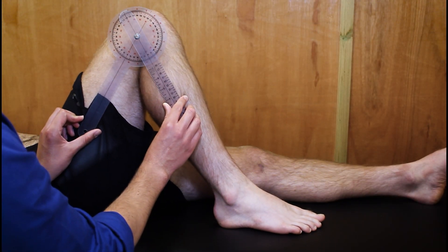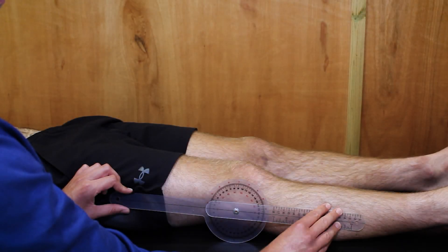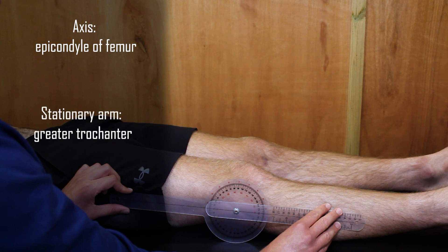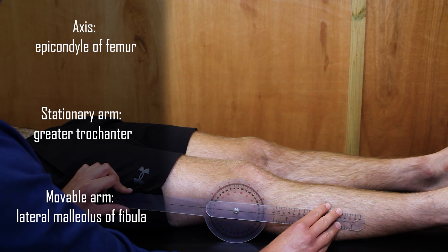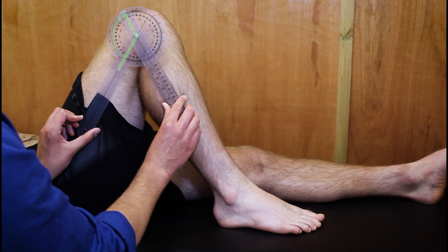To measure knee flexion, the patient is positioned in supine. The axis of the goniometer is placed over the lateral epicondyle of the femur, with the stationary arm parallel to the femur pointing to the greater trochanter and the movable arm parallel to the fibula pointing to the lateral malleolus. Ask the patient to bend their knee as much as possible.